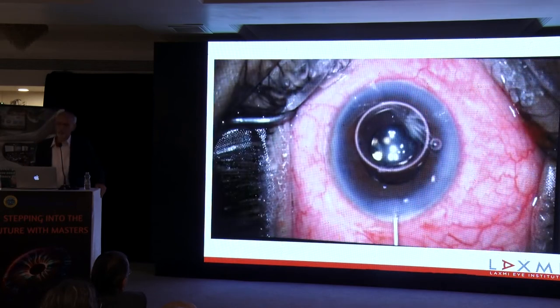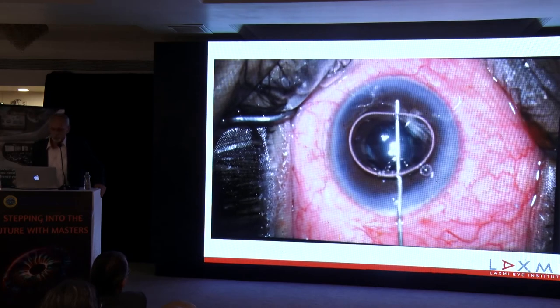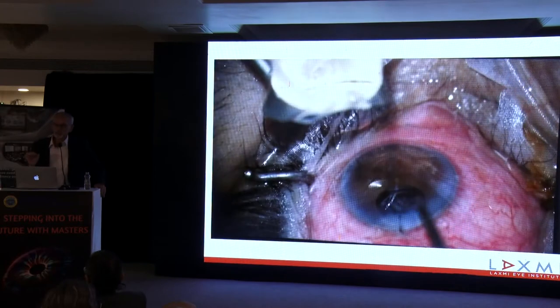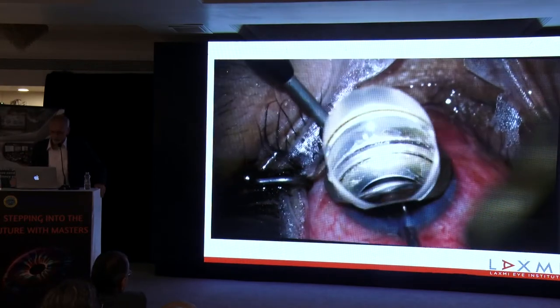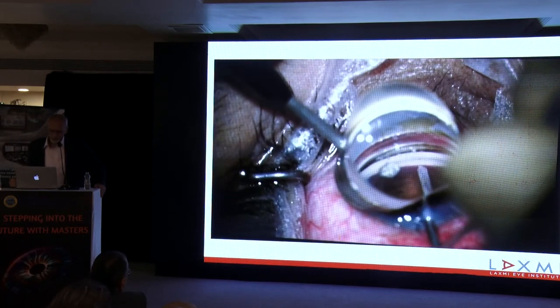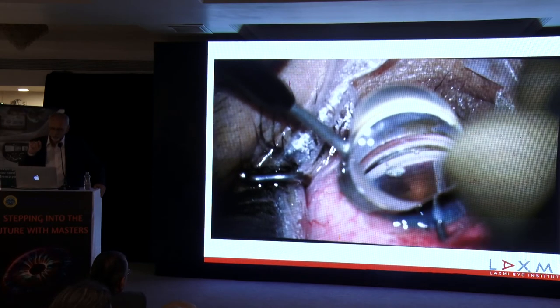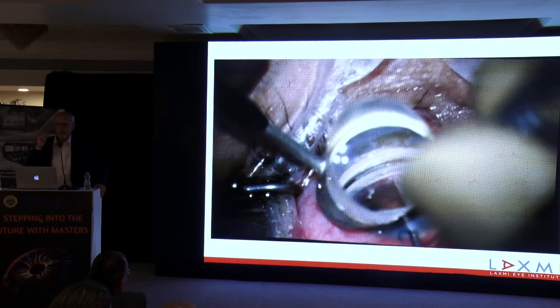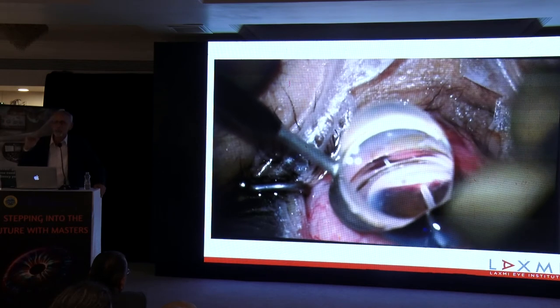But anyway, I thought I had completed the job. And the next step was to go on for HFDS. In HFDS, we constrict the pupil, fill it with dispersive viscoelastic, and with the help of a direct lens, you go with the HFDS probe. HFDS means you create a direct channel between the chamber and the Schlemm's canal. You do it at 6 places.